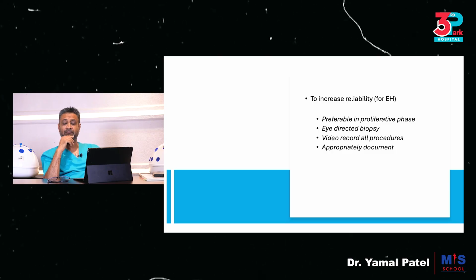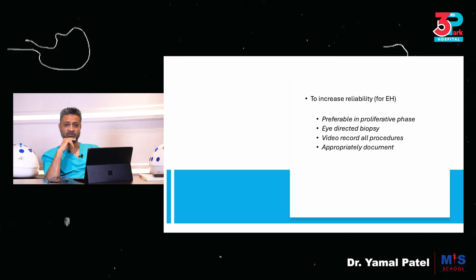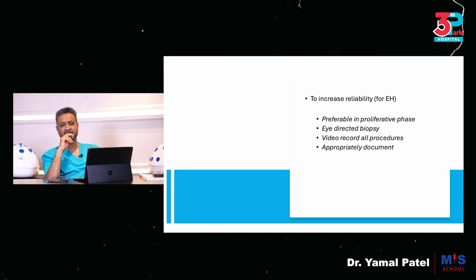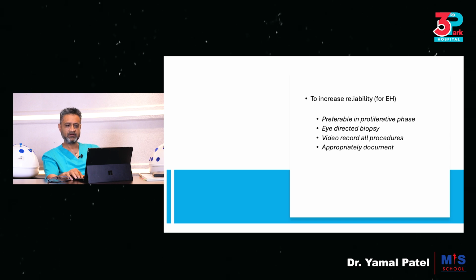To increase reliability for endometrial hyperplasia, I preferably do this procedure in the proliferative phase, when it's a bit easier to see around. It is important to do an eye-directed biopsy; it's not good to do a blind biopsy. You look at the tissue with the hysteroscope, see which area you're targeting, and remove it. Video record all your procedures and appropriately document them.